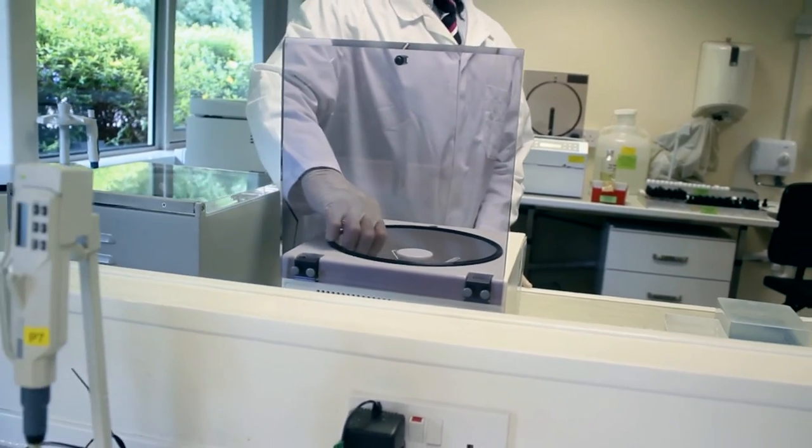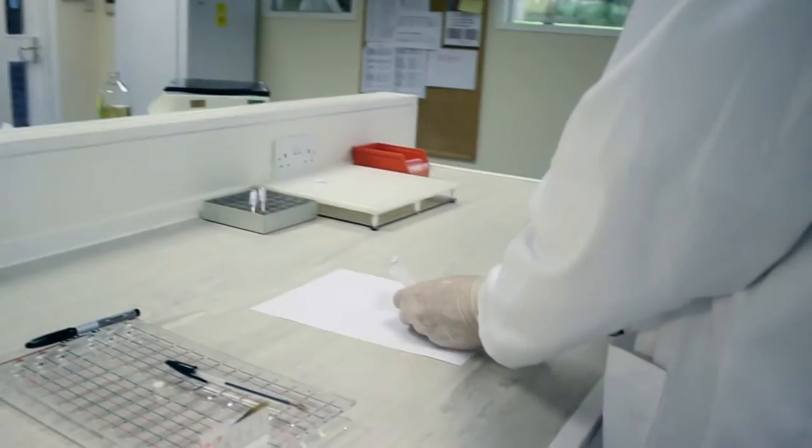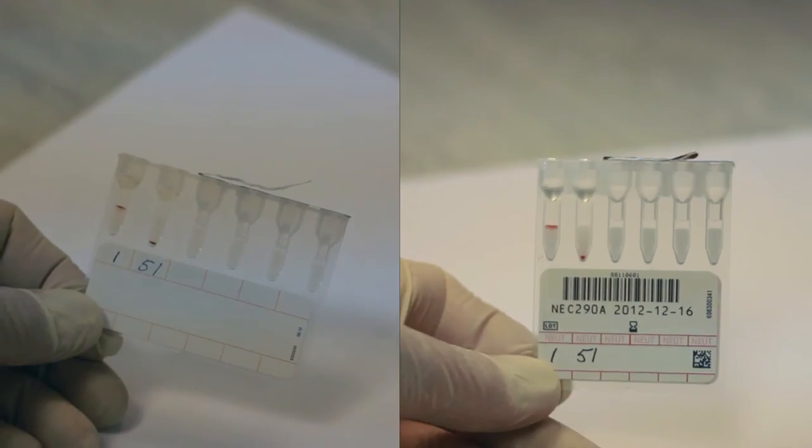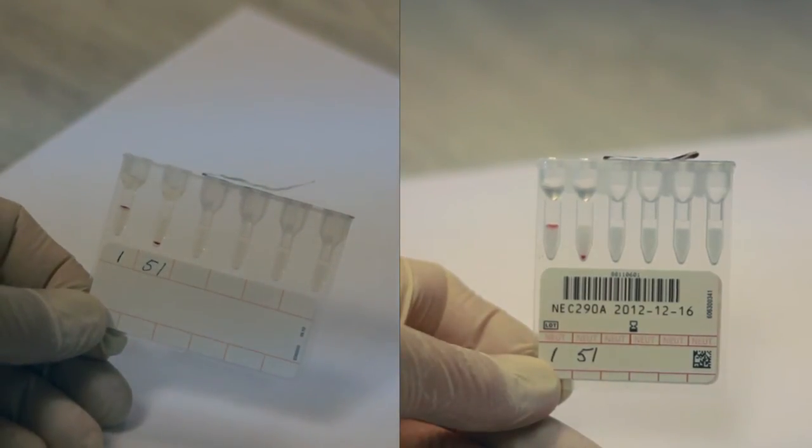Once the card has been centrifuged, the results can be examined. The positive sample can be identified by the thin band of agglutinated cells near the middle of the microtube.